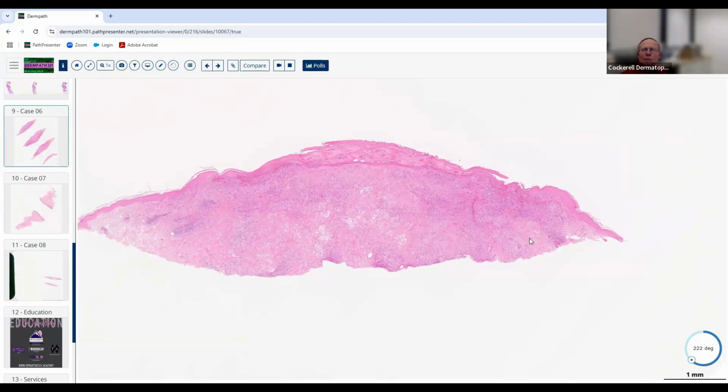And unfortunately, they shaved this. Maybe they thought it was a neoplastic process when they shaved it. Maybe it was a papule, probably a sessile elevated papule, so they just said, well, let's just shave the whole thing off. We would have liked to have had a punch so we could evaluate the breadth and apply all of our criteria for the patterns, but we don't have that here. So we'll just live with what we got.